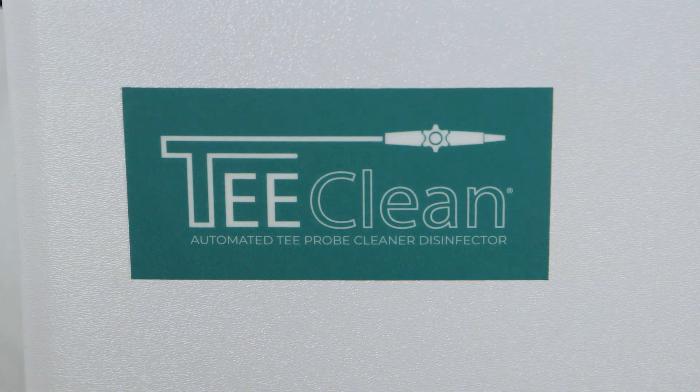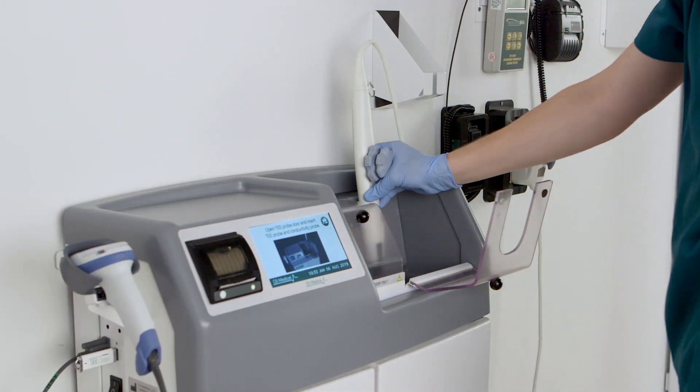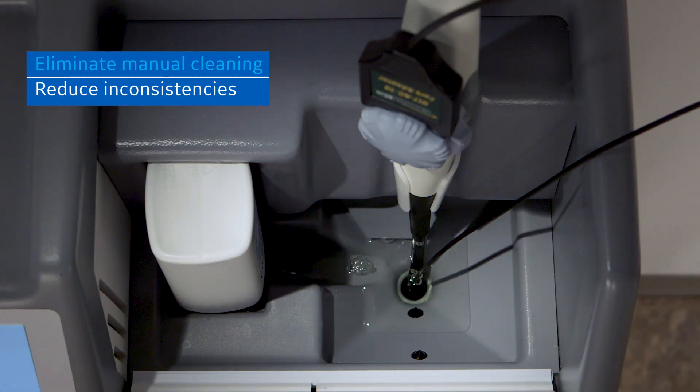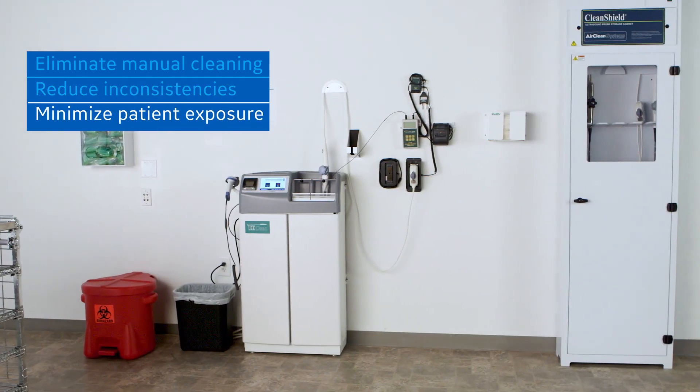T-Clean is an automated solution that both cleans and high-level disinfects TEE transducers. Eliminating the manual cleaning process improves workflow, minimizes inconsistencies, reduces the potential for probe damage due to over-soaking and over-handling, and eliminates the need for a sink.